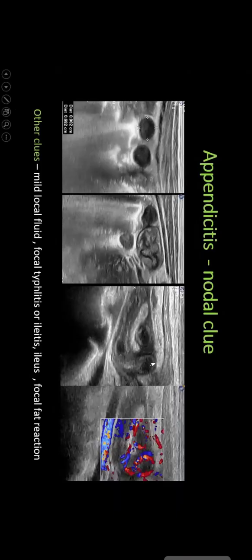Now, appendicitis clues. Presence of small, rounded hypoechoic nodes adjacent to the ileum again suggests infection and inflammation in the RIF. This is appendicitis. Sometimes this comes out in the background of echogenic perinodal reaction. So small, rounded nodes are always abnormal. 9 into 6 millimeter size nodes. Cross-section diameter is 8. There is mild ileal reaction and this is appendicitis. A curved appendix is there.